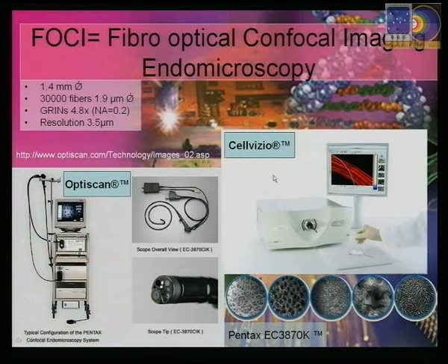There are two main fiber optical confocal systems right now on the market.